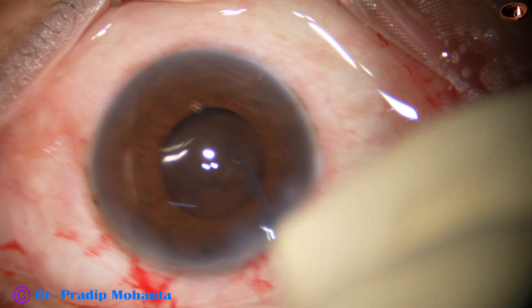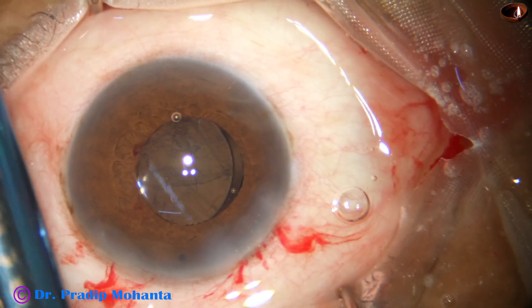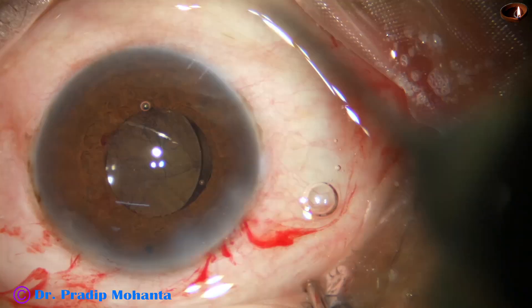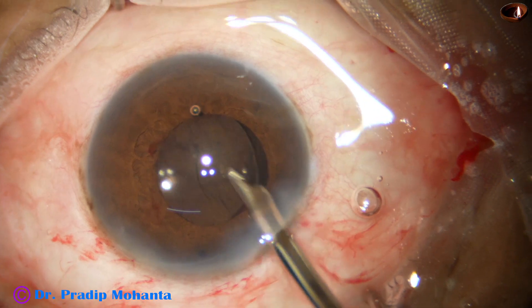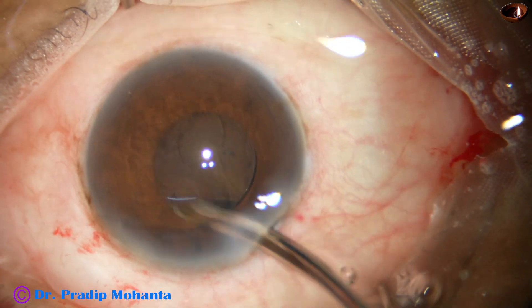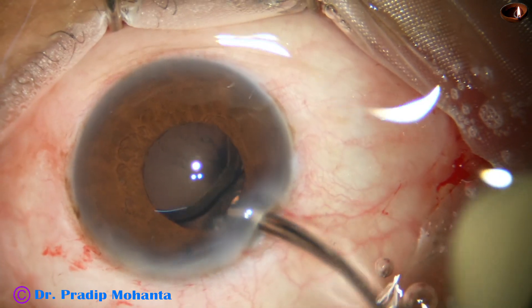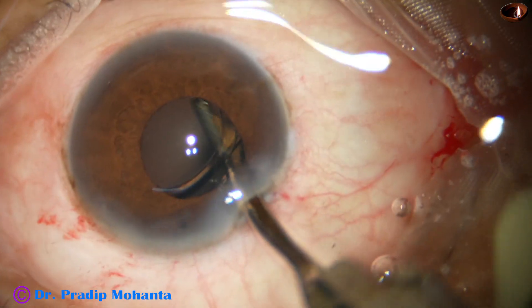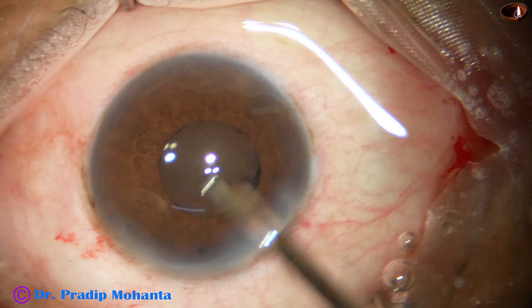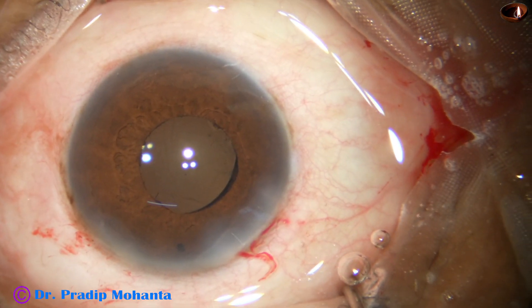But how can we check? We can retract the iris with the help of a Y-hook and check whether the lens is in the capsular bag or not. At this time I am irrigating the visco out. Go behind the lens and irrigate the capsular bag — if we irrigate the capsular bag, most of the visco from the capsular bag comes out, and the chance of raised IOP in the postoperative period will be very, very low.